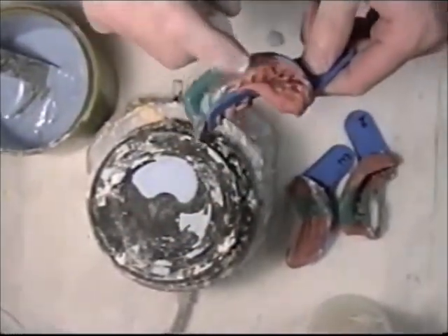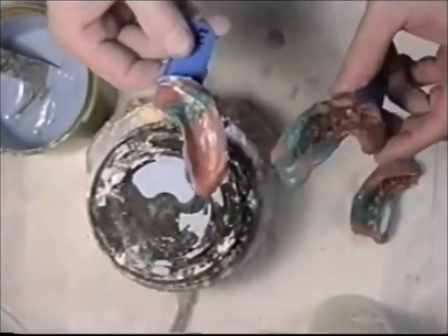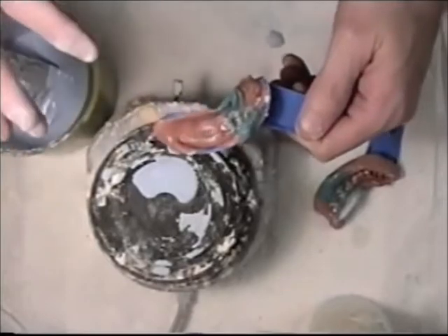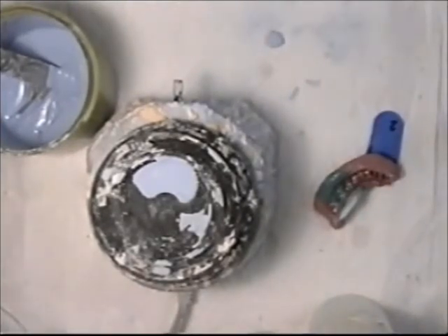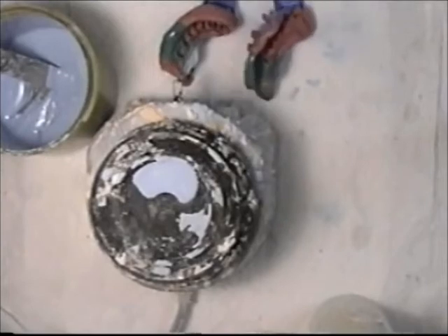Now I'm going to spray these impressions with debubbulizer. This is just a soapy solution with some alcohol, and I will blow off the excess so there's just a film there that will help me to pour without any resistance that may create more bubbles. I blow the debubbulizer off with compressed air.